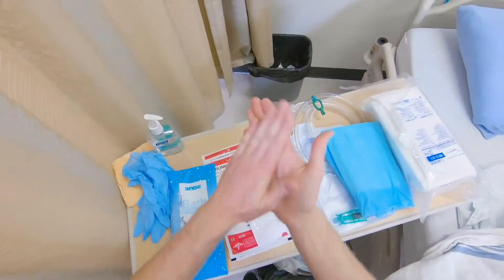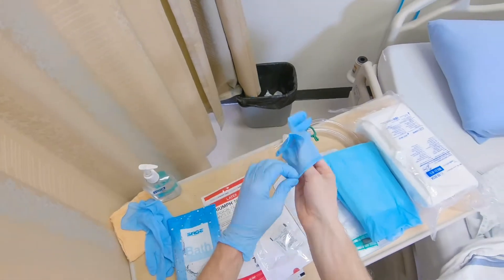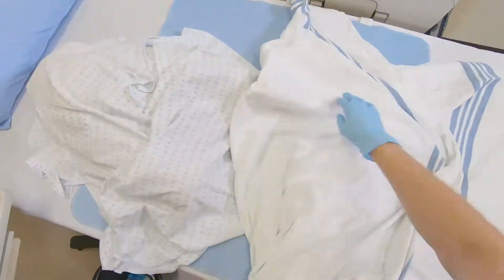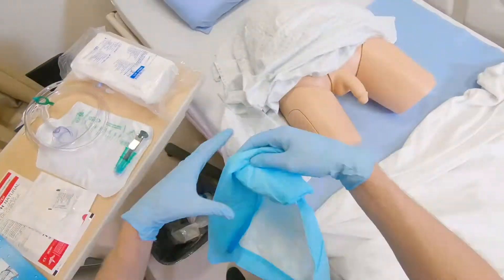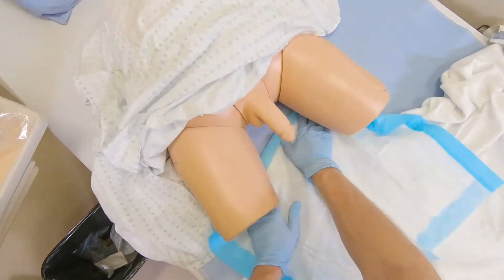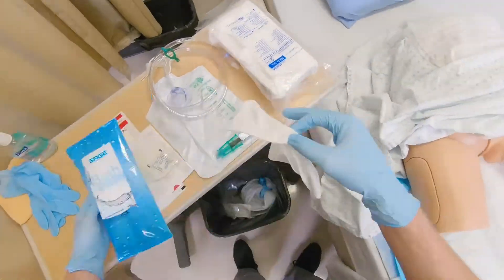First, perform hand hygiene and apply clean gloves. Uncover the area needed and place absorbent pad under the peri area. Then, perform peri care.